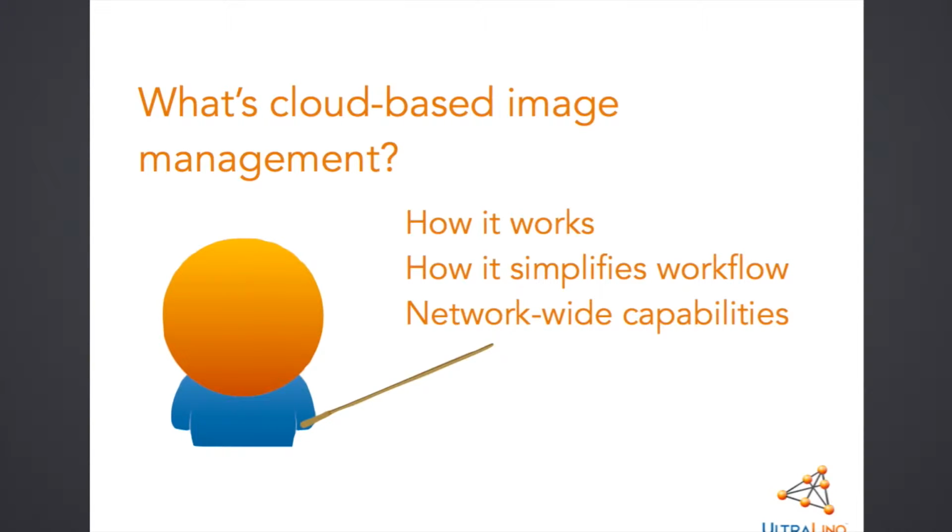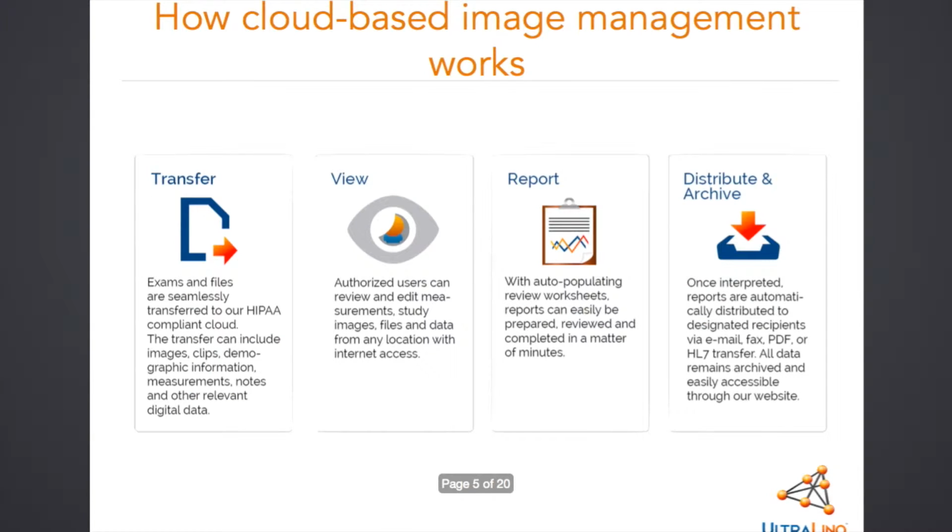First, we'll dive into what cloud-based image management is. We'll talk about how it works, how it can simplify your workflow, and some capabilities network-wide. Cloud-based image management works by sending all related exam information, including clips, stills, patient demographic information, measurements, notes, anything else, which can then be sent over to all authorized users.